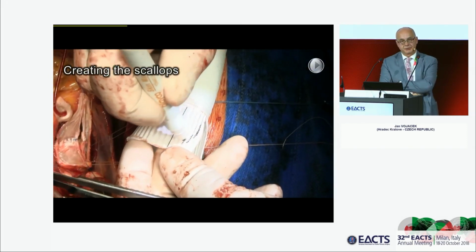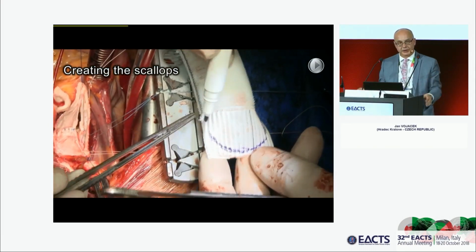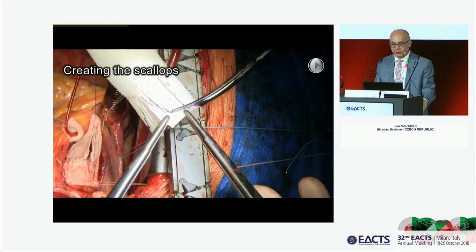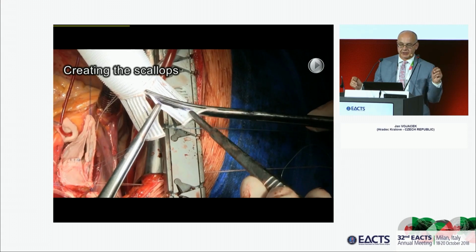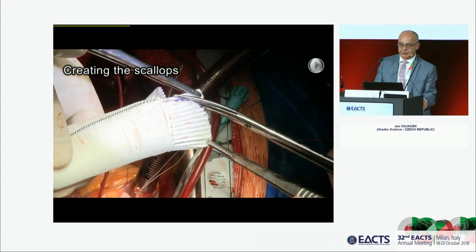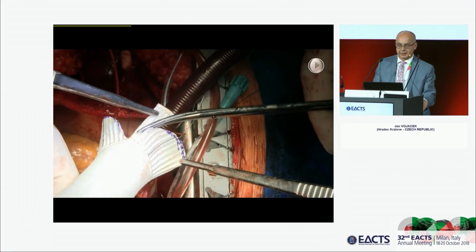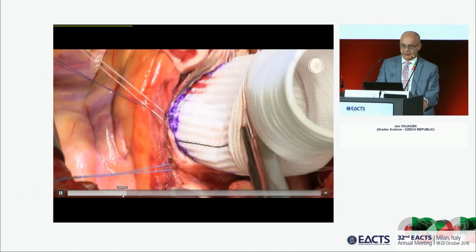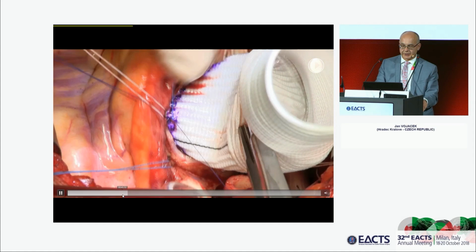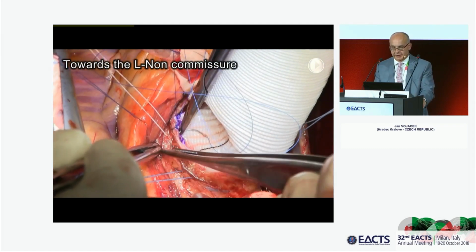Why? Because we know that in case of bicuspid aortic valve, the optimal configuration is like in pure bicuspid aortic valve. There the commissures face each other at 180 degrees. So that's why we create these 2 identical tongues, identical neosinuses. Then this prosthesis is sutured to the aortic annulus, to the leaflet attachment, using this fine suture, and it must be a very delicate and hemostatic suture.